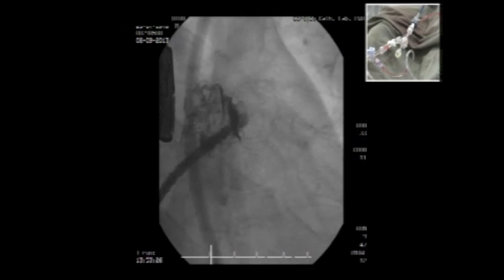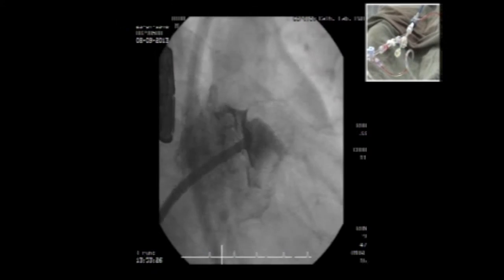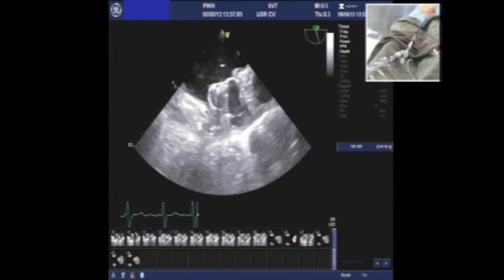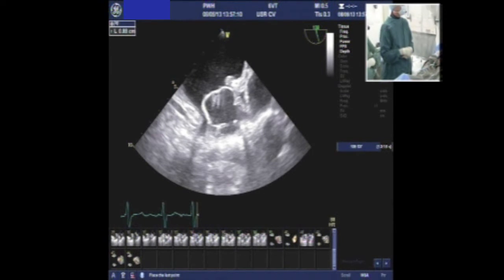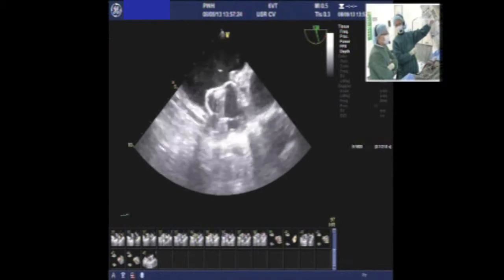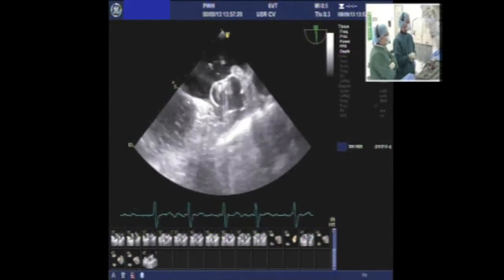Yeah. Can someone do this? So Alex, can you measure the compression by echo? Okay. Yeah. Is it 135? 135. There will be a small leakage. Yeah, it could be, but it could also be that the sheath is moving the whole thing up. So it may come down a little bit when we release it. Yeah.